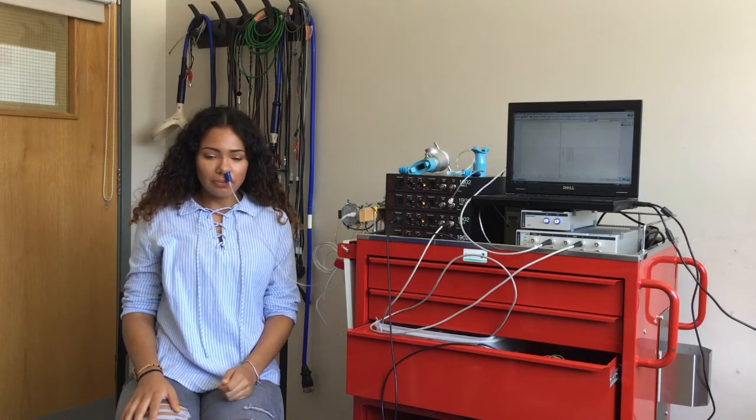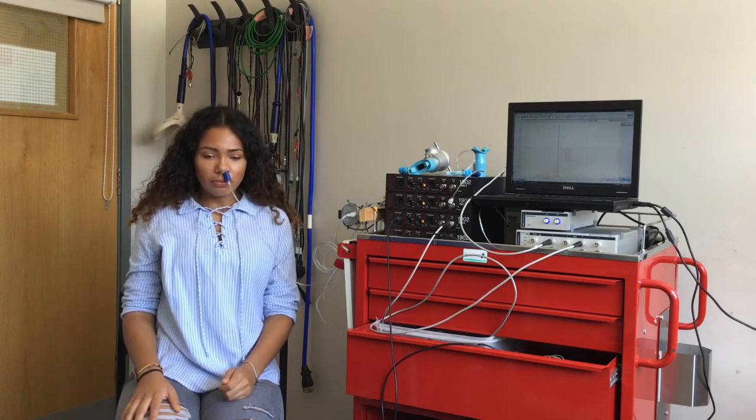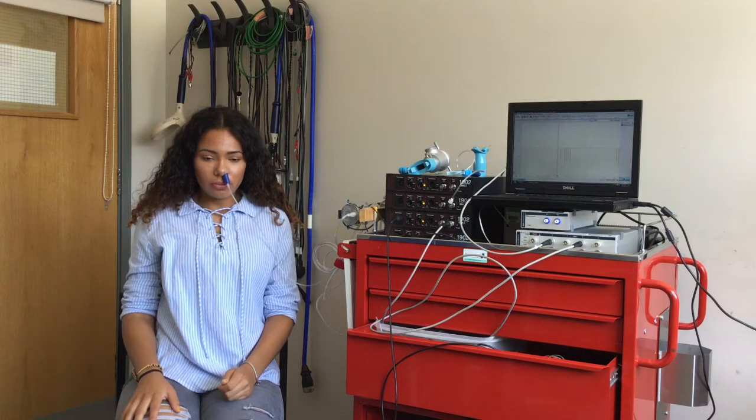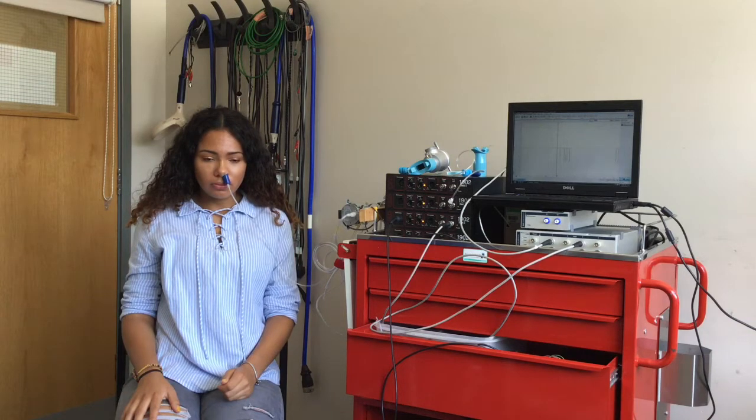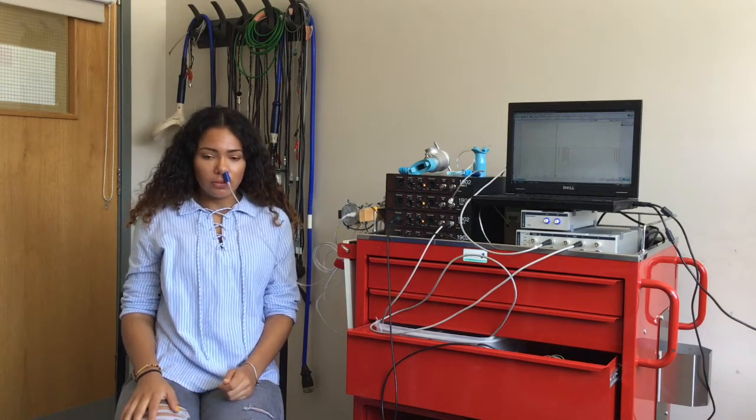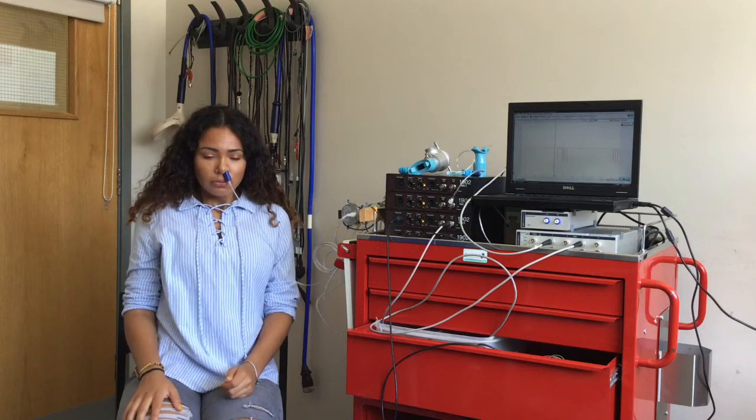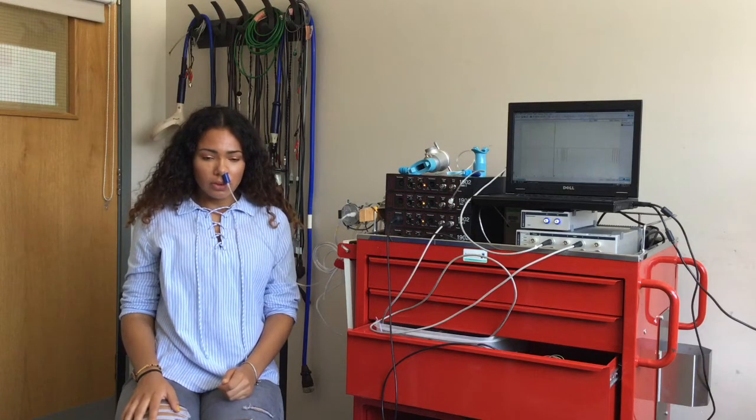Inspiratory muscle strength can be measured by asking the patient to sniff in through the open nostril for as hard as they can in one big sniff with a nose bung attached to a pressure sensor inserted into the other nostril.